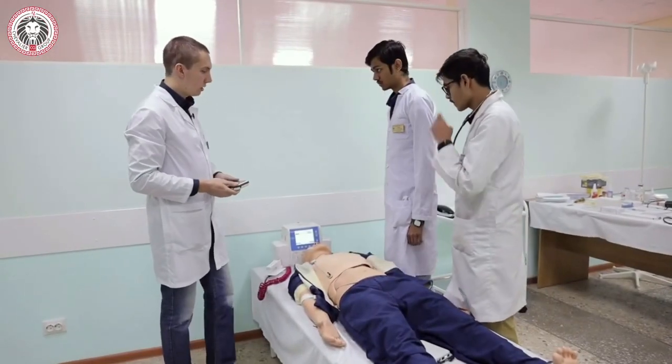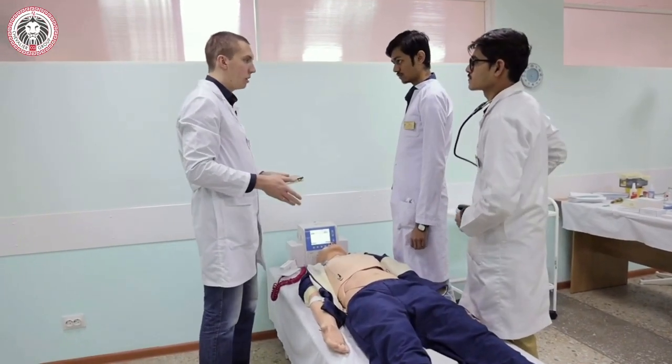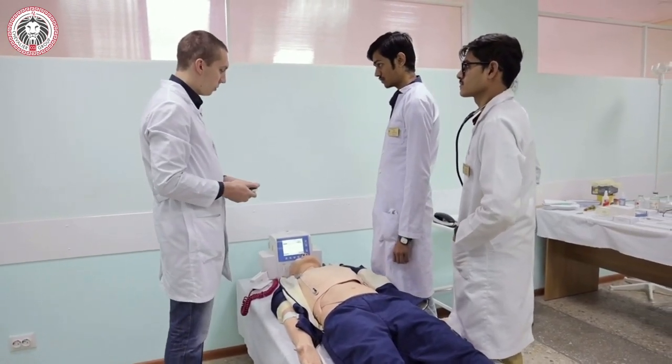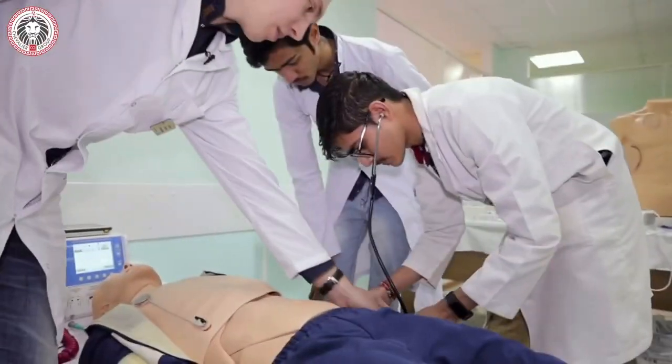Okay, boys, your task here is to resuscitate a patient in clinical death. This type will be ventricular fibrillation.